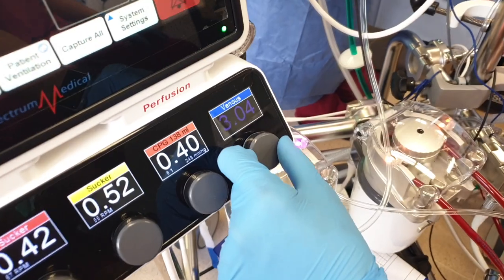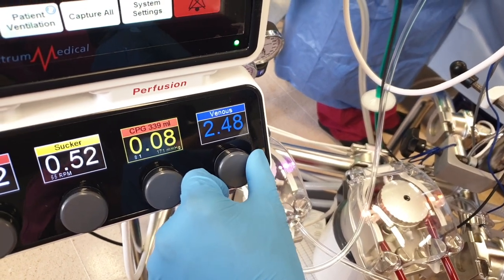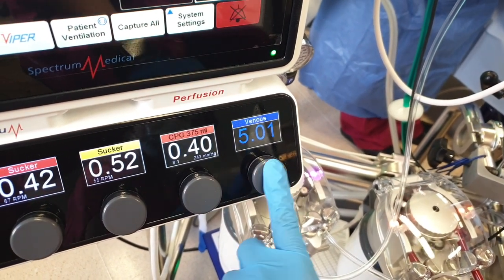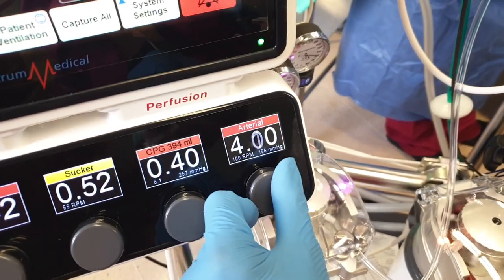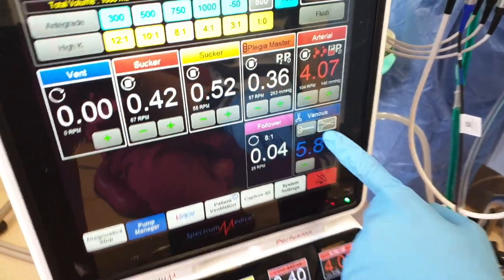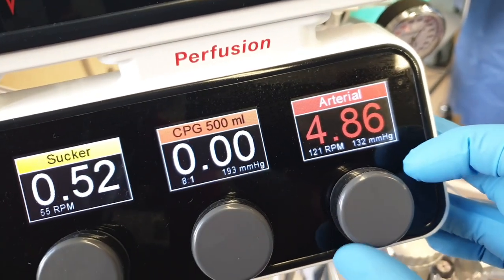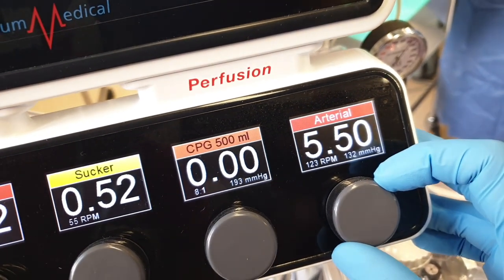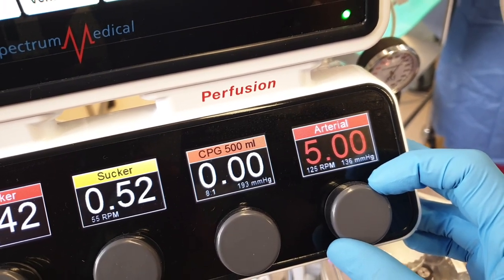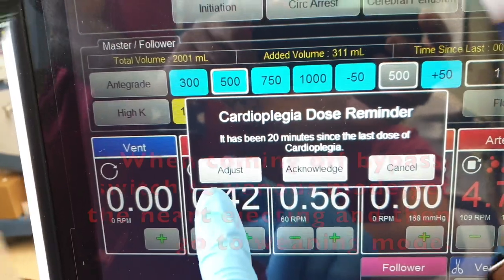I'm going to try to reduce my venous flow. Empty out. Come back with your arterial. If you want to empty more, you can reduce your arterial as well. Always open it so that it will empty out. This is the actual flow which is measured from the probe. If you click once, that's the actual flow that's set up on the pump. That's the computed flow. The white is the computer flow, and the red is the patient's real flow. After that, you can turn off.